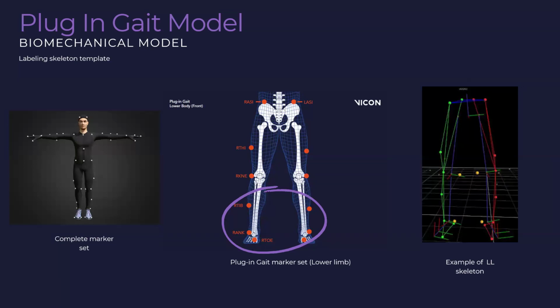Does that capture these things? Can you visualize it? Considering that the foot plate is the ground, you're doing in-place movement. When you visualize it, you visualize it on the treadmill. So it seems stationary, but just the legs are moving. It's just for the purpose of visualizing it.